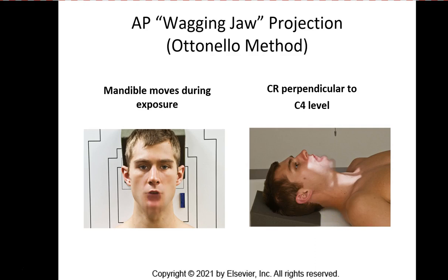The mandible, however, in this projection should be constantly moving during the exposure. So this is kind of silly if you can imagine. You don't want the head to move, you don't even want the teeth to make contact, but you want the mandible to move up and down while you make your exposure.